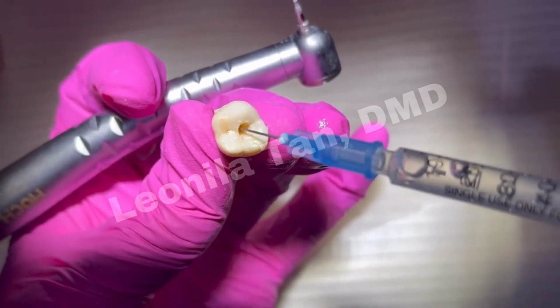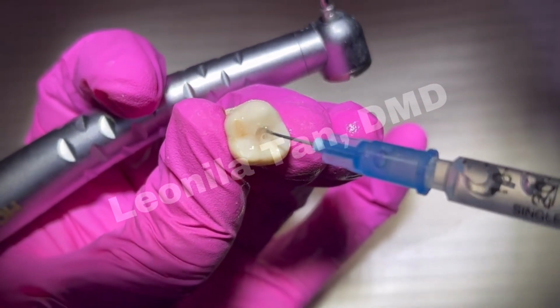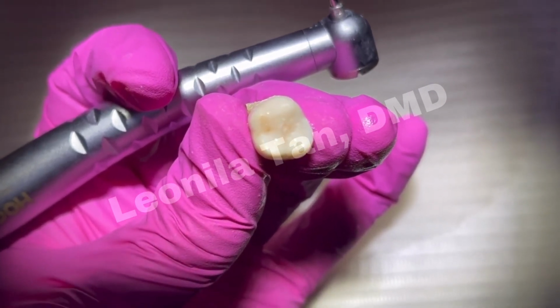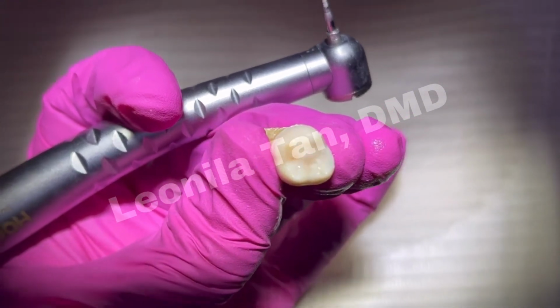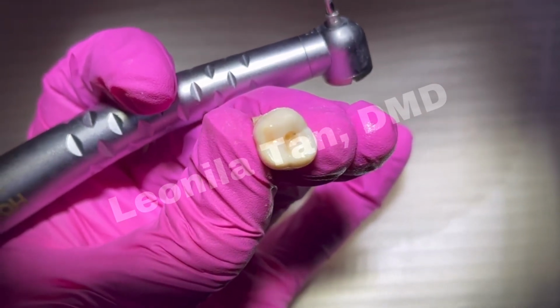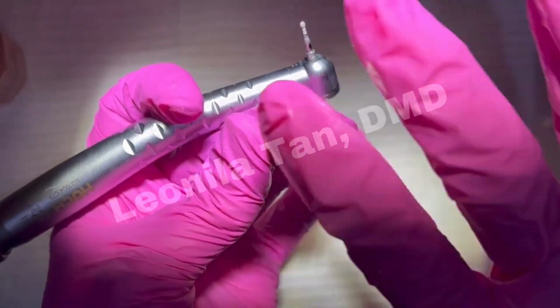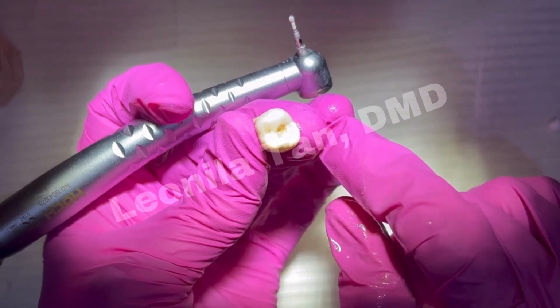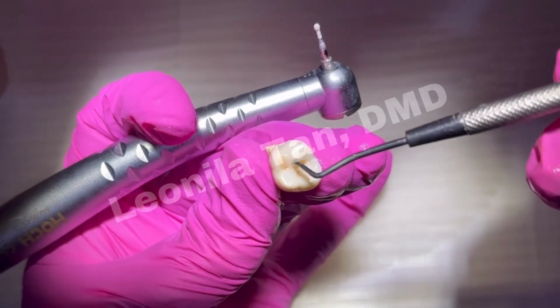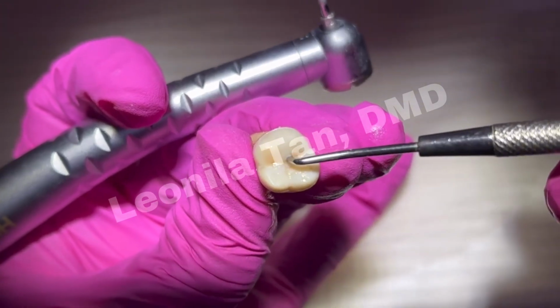Once open, again, the rule: once you have located your chamber, irrigate, never air dry. Once you irrigate, dry with your pellets. Also, if this was a vital tooth, there would be blood. That's okay. You just have to irrigate, clean it with your pellets, and scoop out your coronal pulp using your Endo explorers.